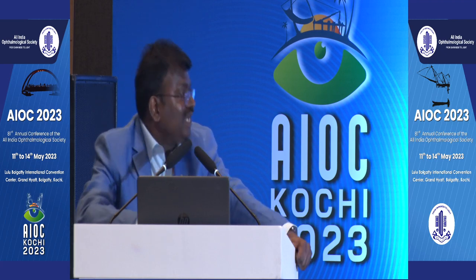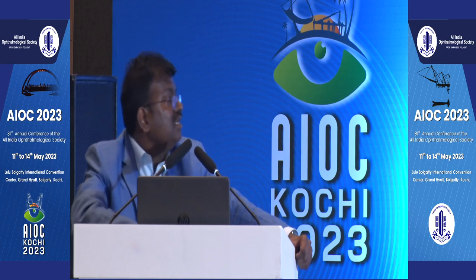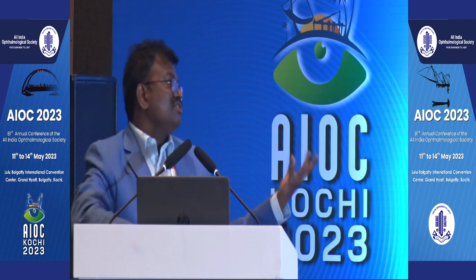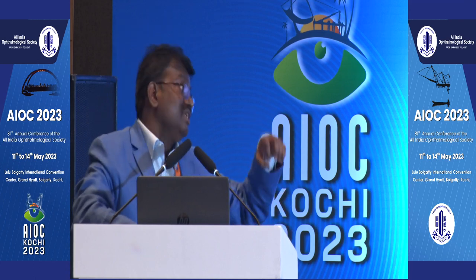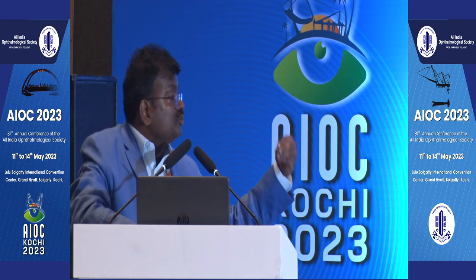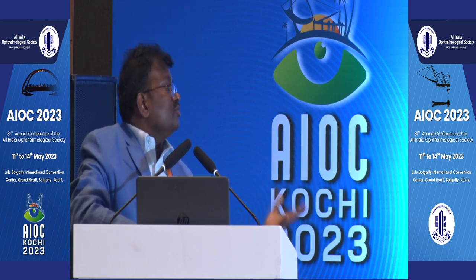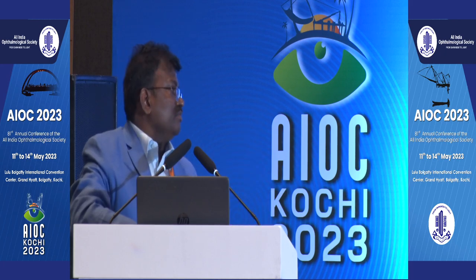Yes. As I have told, don't do much vitrectomy. In fact, nowadays I don't do vitrectomy at all. First, tackle the membrane and then do the vitrectomy, because when there is vitreous, it is not allowing the retina to settle. And if the retina is shallow, we can do one more thing: make the port, and through the port infuse the fluid so that the retina becomes much more bullous, and then you go and approach the membrane.